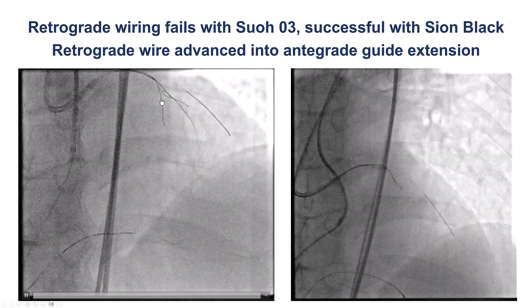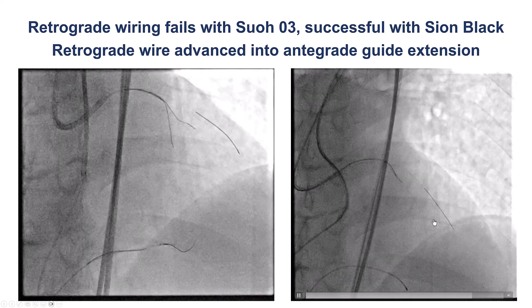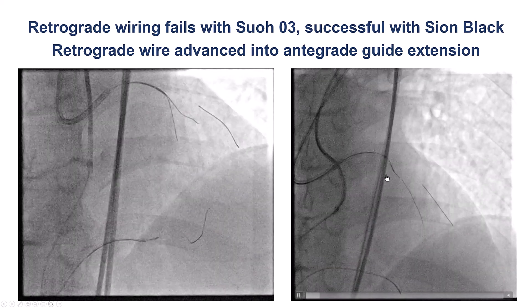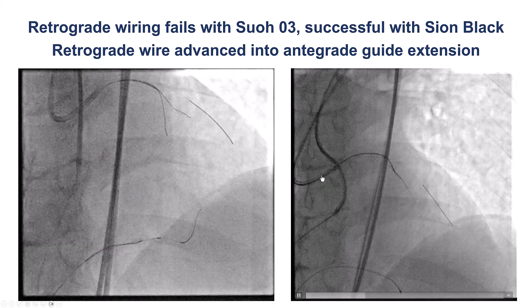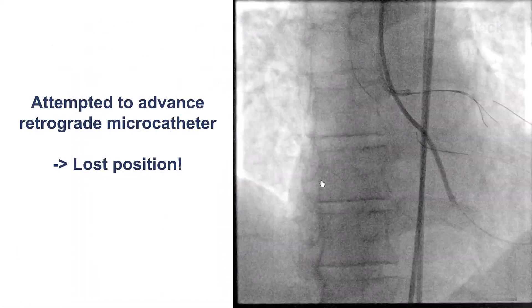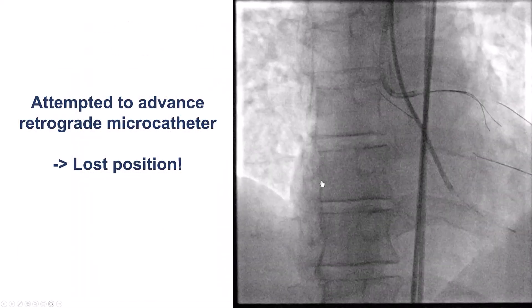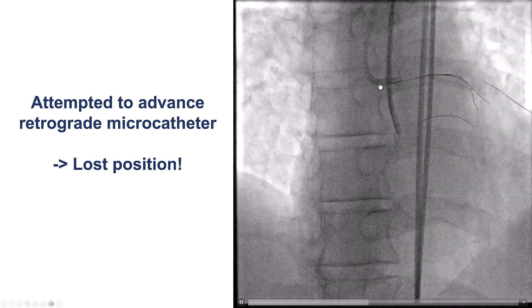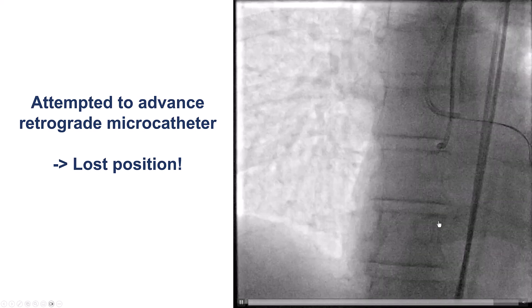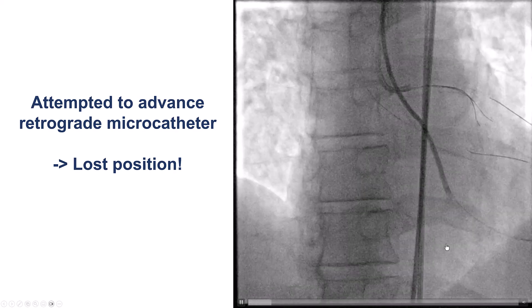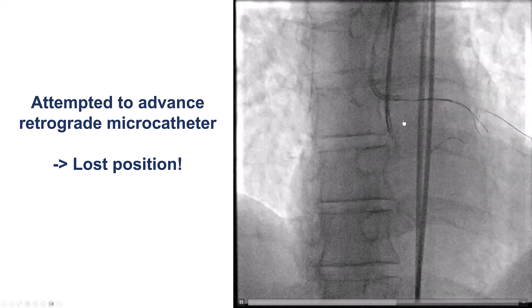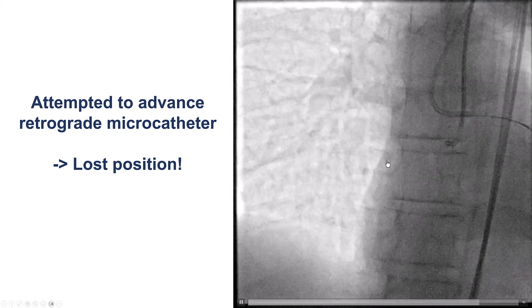To our surprise, this retrograde wire easily crossed through the occlusion and went into the antegrade guide catheter. However, despite trapping the retrograde wire into the antegrade guide catheter, we couldn't get the retrograde microcatheter to track. In the process, we lost our position.